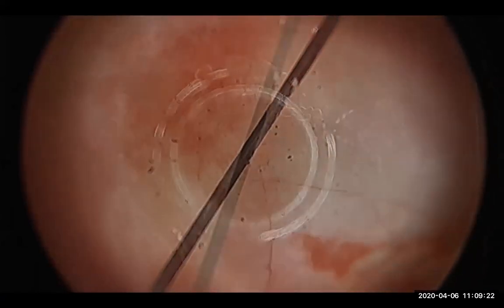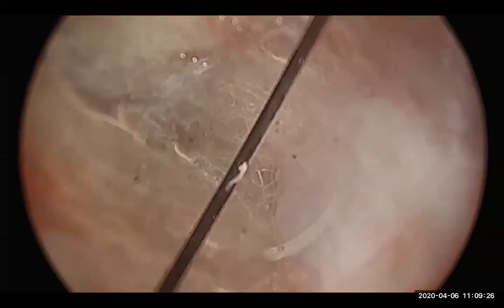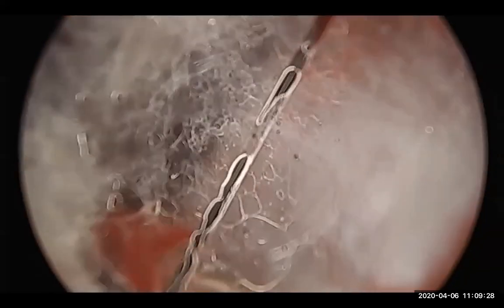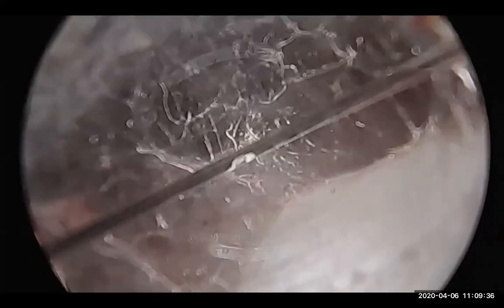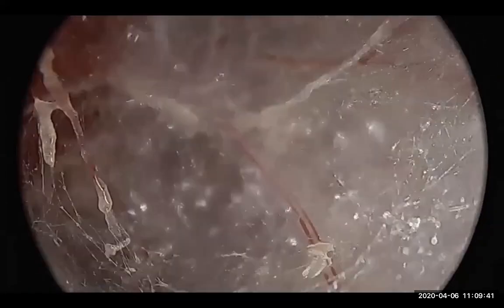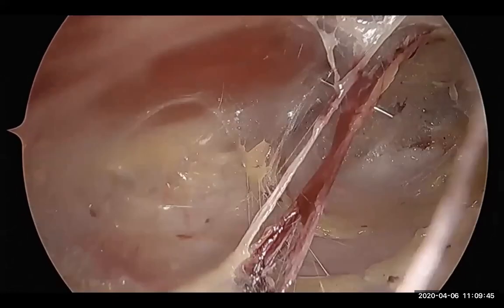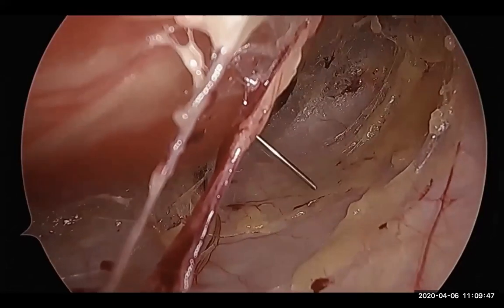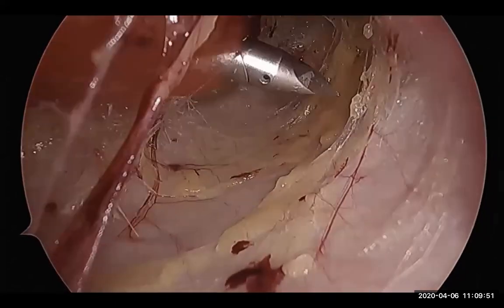Then we depress the port and go in, and the insufflation starts once you're inside. It opens up the space immediately. So you can actually go in and divide some more fibers of the areolar tissue here. Then you take the trocar out and pass in the scope and do dissection with the telescope. Before long, you have the initial space which is visible. You can see some perforators, and a needle tells you where to place the port.